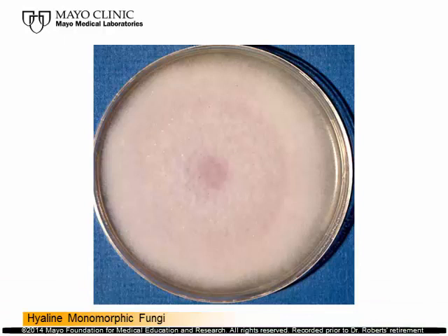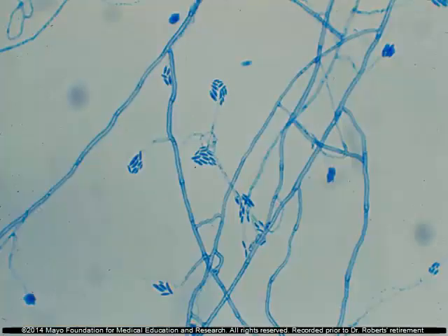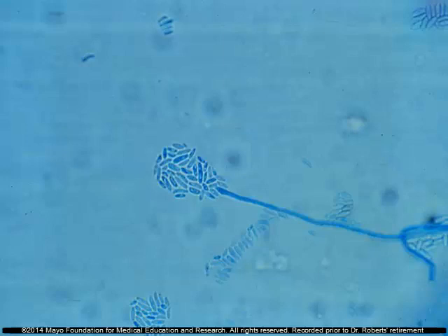Here's a better example with the lavender color. Fusarium produces a reddish to purple color, and sometimes a yellow. Looking at colony morphology doesn't always tell the full story because they vary so much. At first glance, Fusarium would look like Acremonium — the conidia in a cluster at the tip of a long phialide are more elongated in shape and are macro conidia of Fusarium. That long phialide is pointed at the tip, and at the tip you see this cluster of canoe-shaped macro conidia. Someone might say it looks like Acremonium, but it's Fusarium.